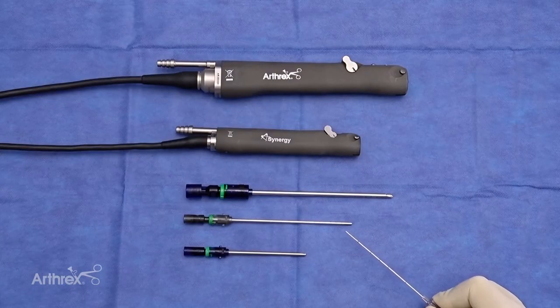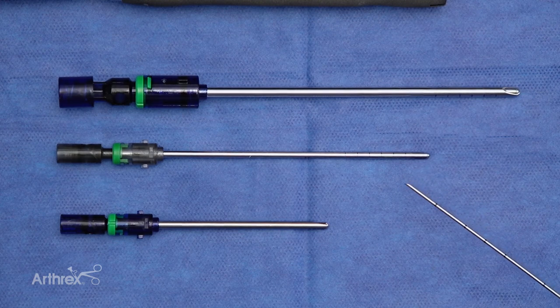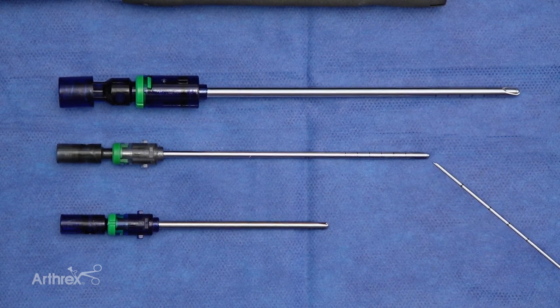As you can see, the working length here is an excellent option for the times you'd want to use a longer working length in the ankle. For example, in the prone position when you're shaving an os trigonum, if you're doing an endoscopic Haglund's excision, also from an anterior arthroscopy when you're doing os trigonum excision anteriorly, as well as trying to reach the medial and lateral gutters — this also gives you a better option with longer working length.